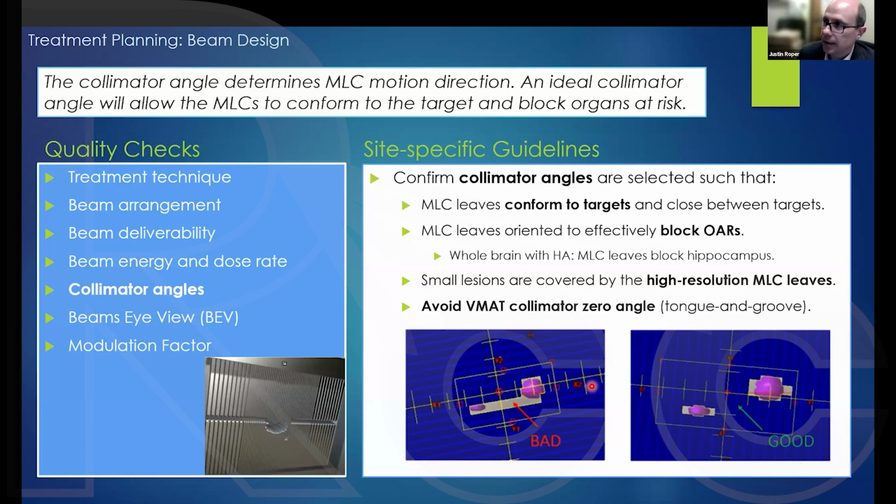Okay. Now let's move on to a couple of more technical questions. And here's the first. Is it better to use 10 flattening filter free in treatment, I think generally? And this may be as opposed to say 6 triple F. What are the considerations there if you have the choice between the two?